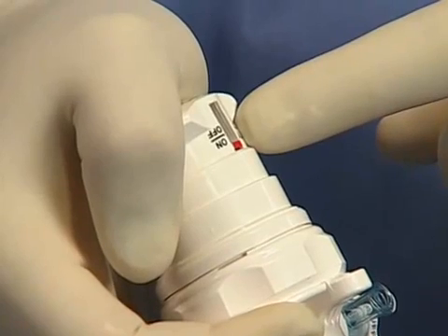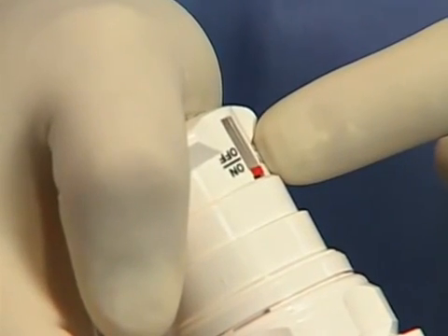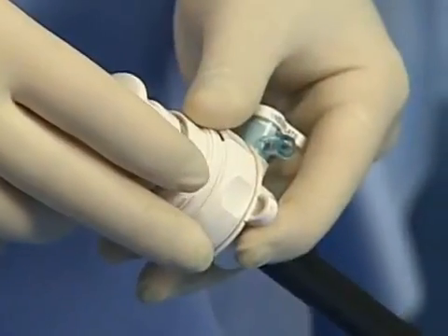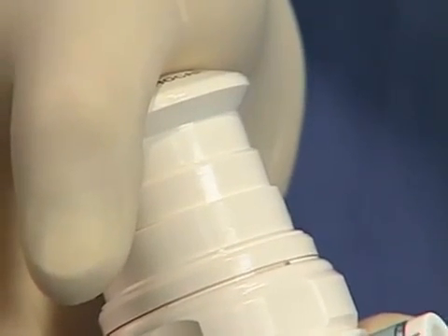The red flag in the shield indicator appears in the on position and is confirmed by the second audible click during insertion. If your Trocar is extra-peritoneal, simply reinsert the obturator and squeeze the obturator and housing assemblies together to enable the shield to retract.